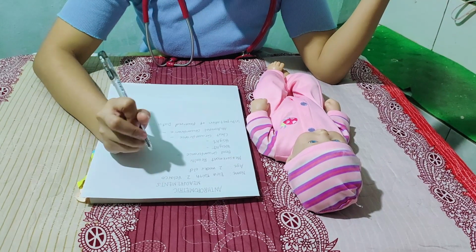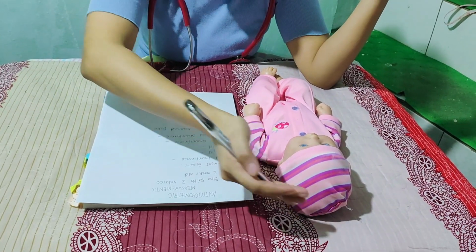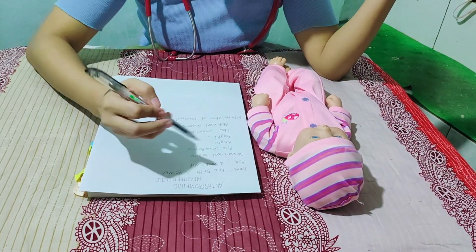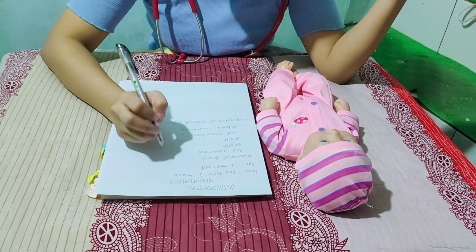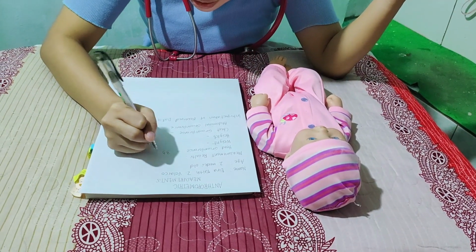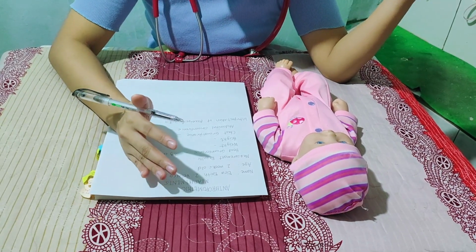Now we will write all the data of the anthropometric measurements of this baby. First, the name, and the age is 2 weeks old. We will write here the measurement results that we had earlier. For the head circumference, we have 33 centimeters. It is in the normal range.